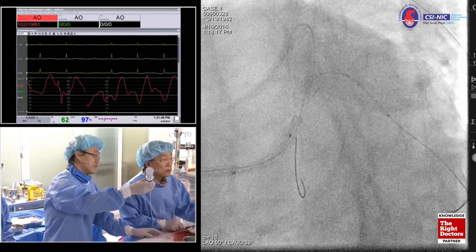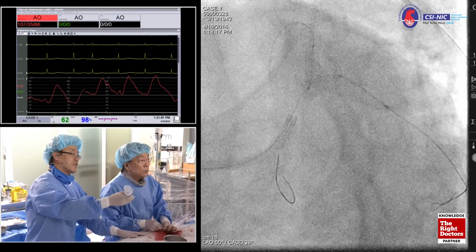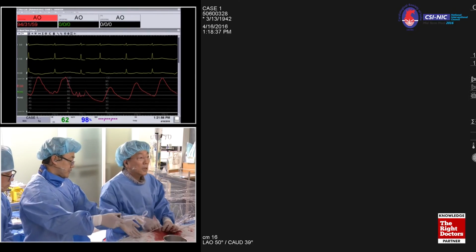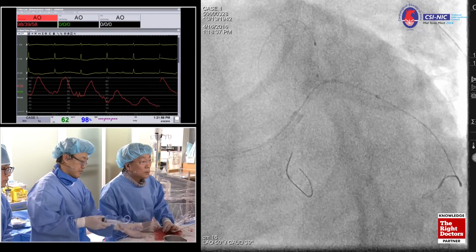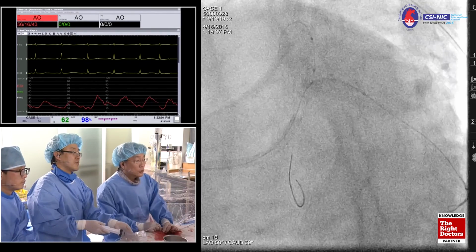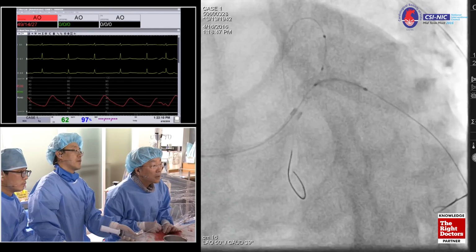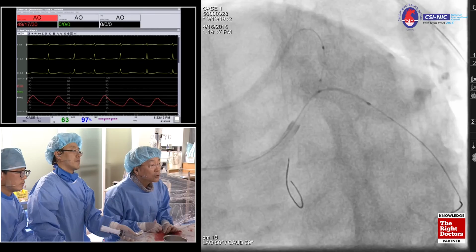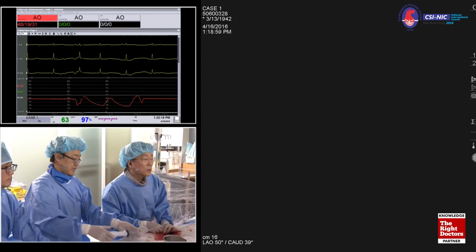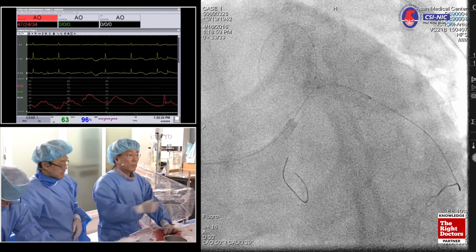The guide is outside the ostium, however coaxiality is good. Okay, good. Balloon pass is not too difficult. Okay, here we are. And then we're going to pull the stent out a little bit in the main side. I think it's too much. I just want to see the flow. Okay, I don't want too much. Okay, contrast please. I think it's quite enough. What do you think? It's okay? Would you show us the area view? This is the area.